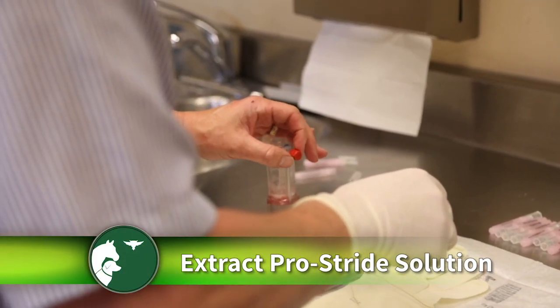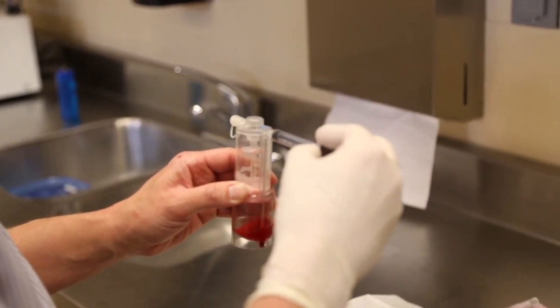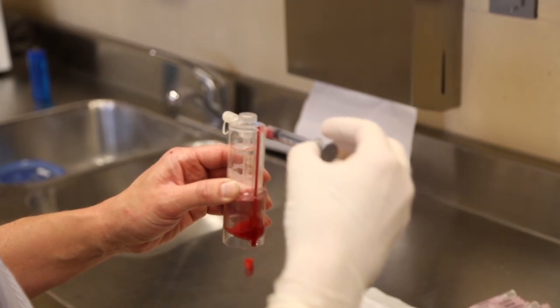Remove the red cap, number 2, and connect a 5 or 10 ml syringe you will use to inject. Extract the solution into the syringe, then disconnect from the device.